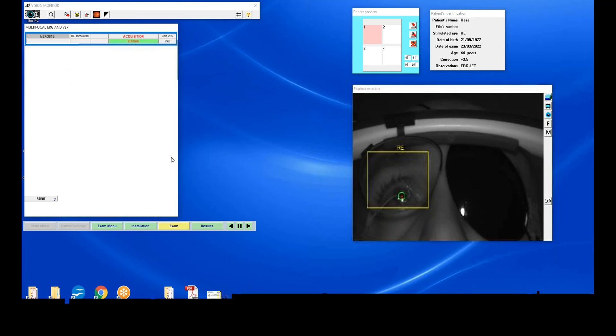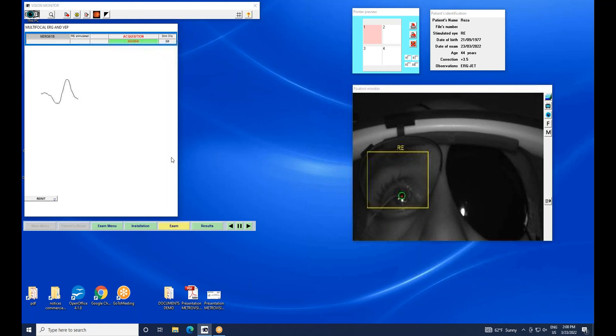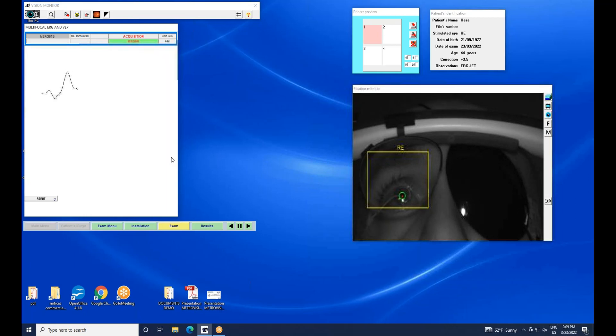Electrodes were okay, so I have started the exam by simply pressing the exam button. What is displayed now is the response after each stimulation, which is actually the sum of all the responses to the different hexagons.